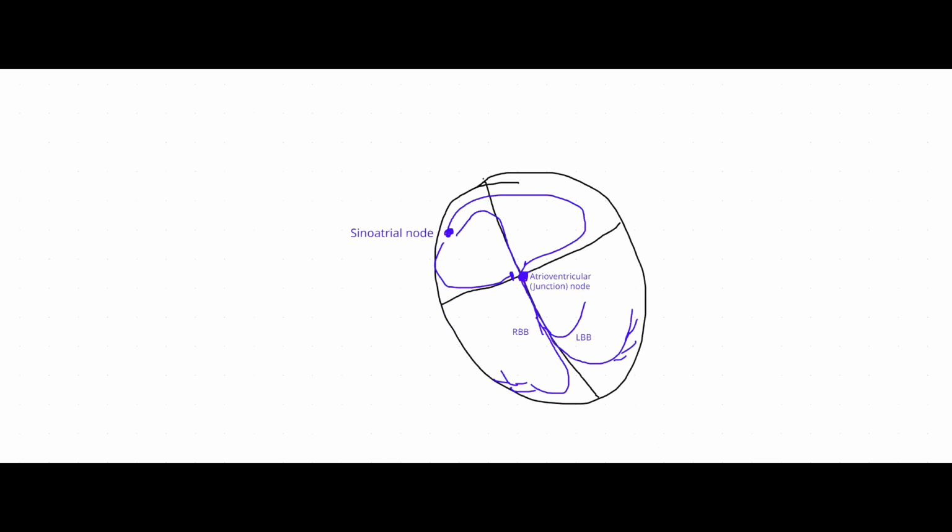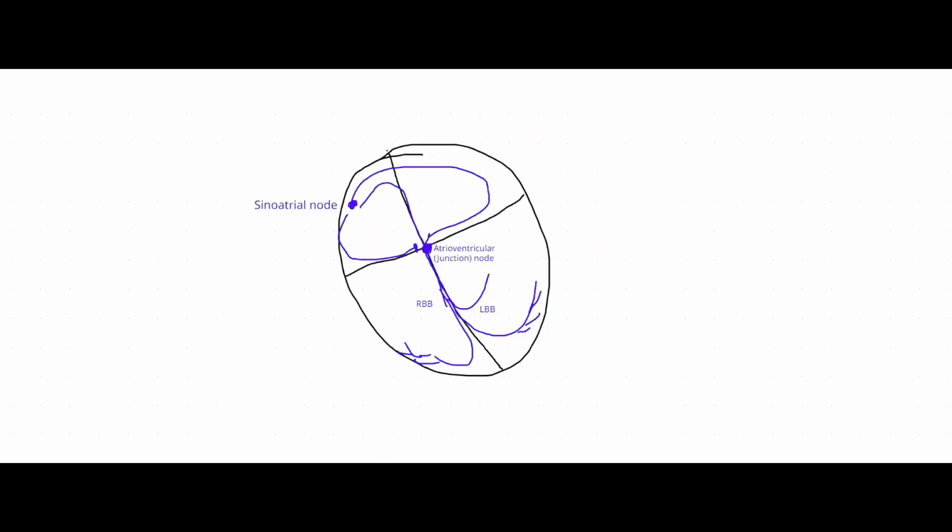So in those leads, we would put 1 lead here, right? So you have a lead here. And then from that lead, you go here on the other side. So this could be like in the arm or the chest, right? And then you have another one kind of at the tip here. Those are the little patches, right, that we put. And then I'll draw a diagram here in a minute.